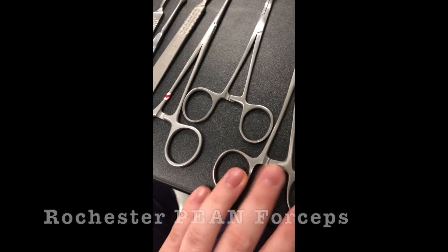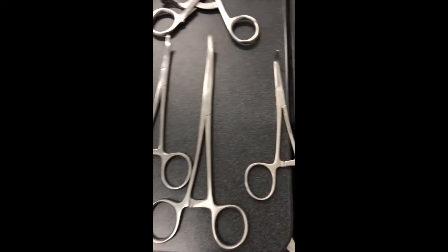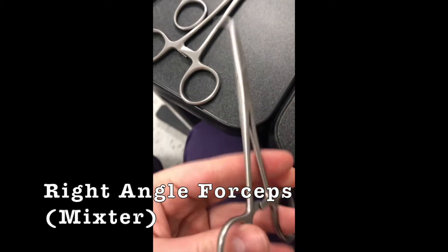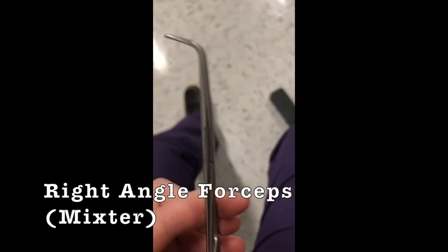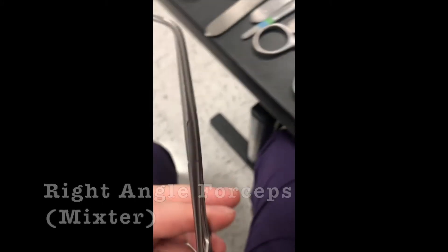And then you've got the Pean — the Pean is the big one. And then you've got your 90-degree, your angled — Mixter or a right angle. Right angle. And it's a Pean. No — right angle.